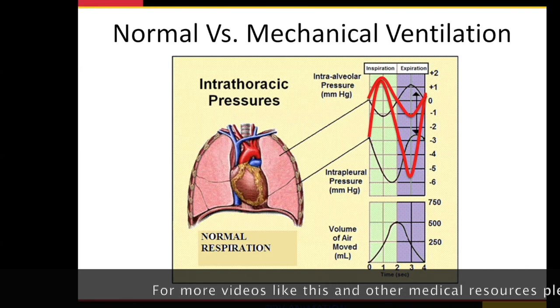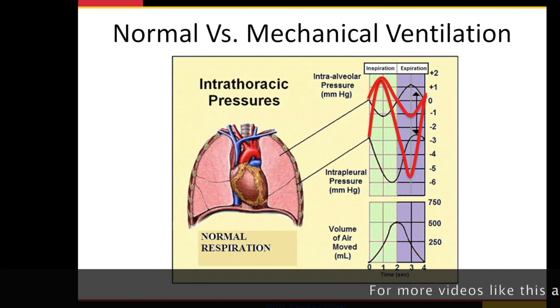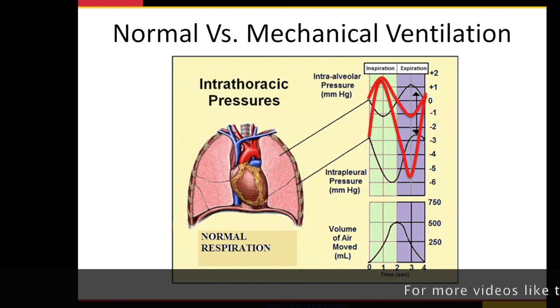In a subsequent talk, which you will have a link to at the end of this, I talk about the hemodynamic consequences of doing this, one of which is you can make them very hypotensive. So it's not necessarily the drugs you're giving to intubate them. You might do a really good job picking the right drugs, but the process of positive pressure, this transition, can shut off their IVC and decrease their preload. They get profoundly hypovolemic. I think this is missed a lot when we put people on. So something to be aware of, whole separate talk, but the process is a complete reversal of our normal physiology.